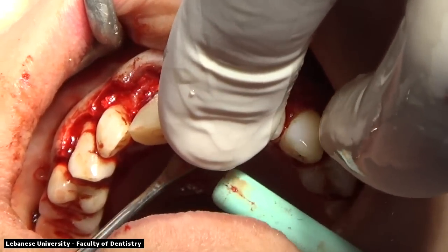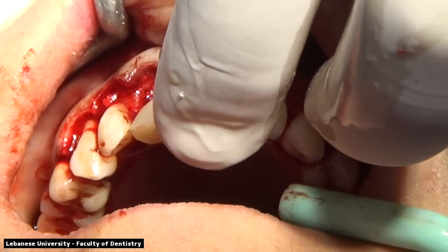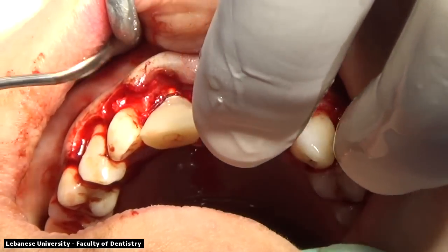Checking the palatal aspect and the buccal aspect to make sure that there is no excess cement coming out. There is no cement coming out from either side.